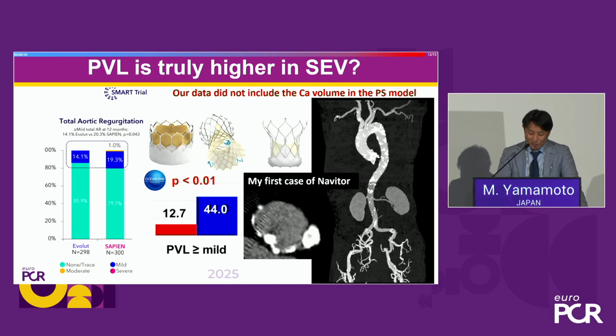This is my first case of Navitor with huge calcification. For such a patient, we prefer to choose a self-expandable valve. So I think the difference in PVL rates may be a little bit overestimated in our daily practice. Okay, so this is a summary.